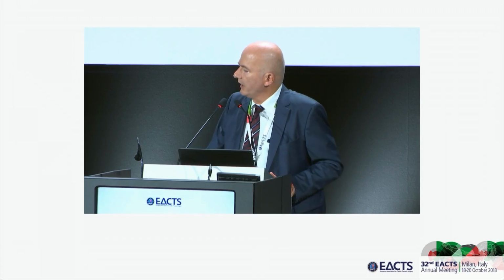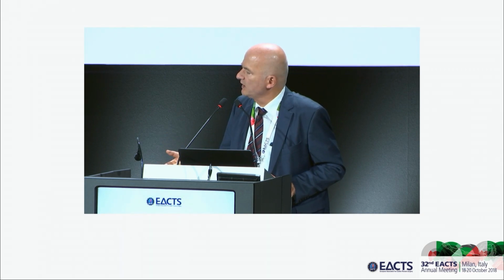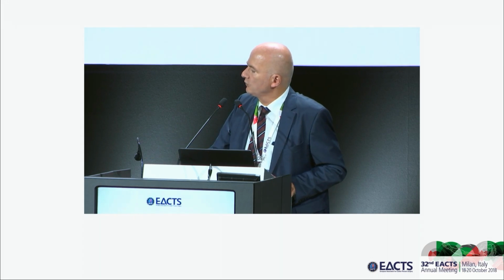Actually, I'm doing annuloplasty in all isolated valve repairs, whatever valve it is. We definitely need it in bicuspid. We definitely need it in unicuspid, unless we're dealing with a pediatric patient. In tricuspid, we have not yet seen the effect. On the other hand, this effect may become more apparent within the next 1 to 2 years, so I'm continuing to use it, and then we'll do the analysis.